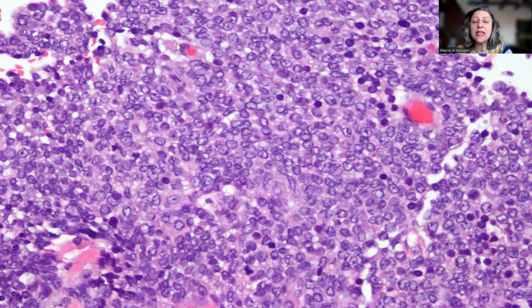And this is the dark staining area. As you can see, this is cellular, composed of proliferation of cells with round nucleus, with a small prominent nucleolus. There isn't much in the way of grooves. This is extremely important because remember, granulosa cell tumors, adult type, usually show the grooves. Characteristically, the grooves are very important in establishing the diagnosis of adult type granulosa cell tumor. But in this case in particular, there weren't any, and there was a small prominent nucleolus.